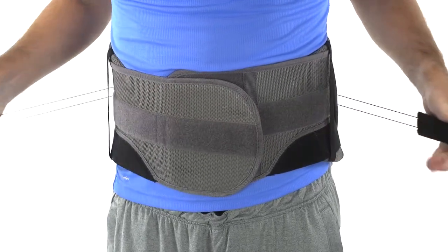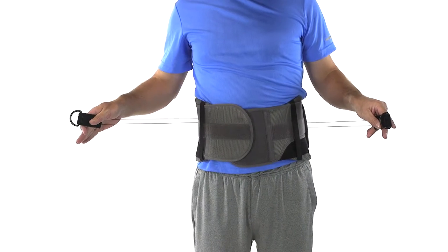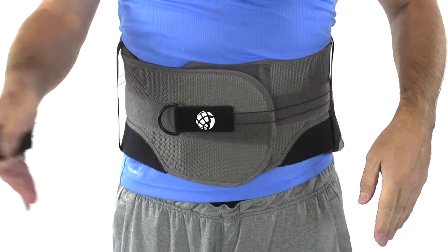Now pull the two handles out and away from the pulley unit to set the desired compression and support. Once satisfied, place the handles on the velcro-like material to securely hold the handles in place.